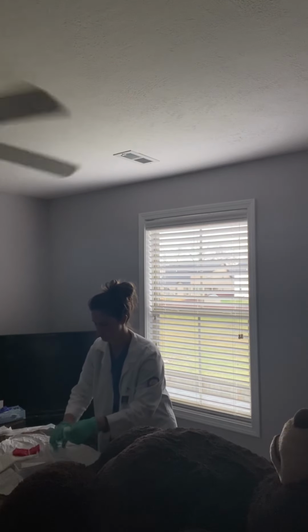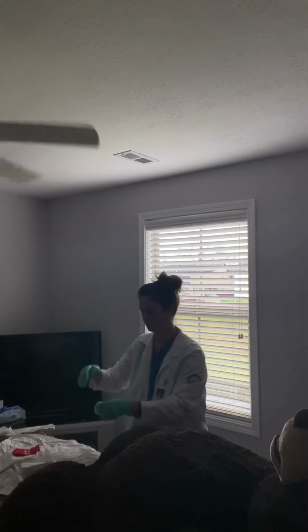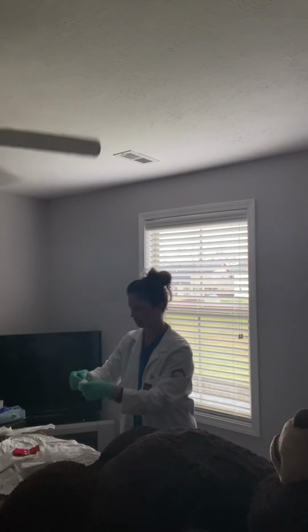Now we're going to go ahead and pack the wound. So I've got a forcep and an applicator here that I'm going to use. This one, since it's pretty deep, I'm going to use quite a bit of gauze here. And you want to make sure that when you do pack, that you're not tightly packing it, but making sure that it doesn't overflow the wound.